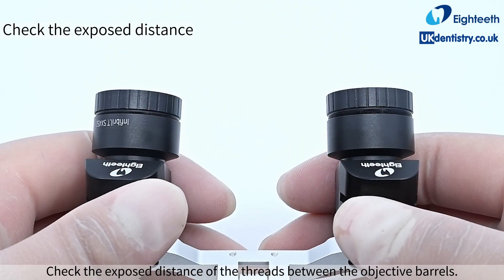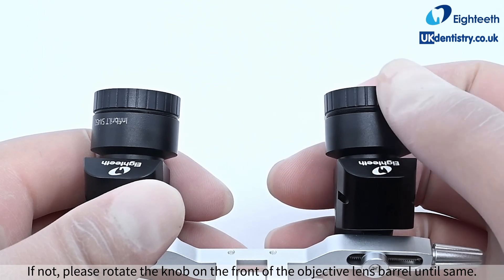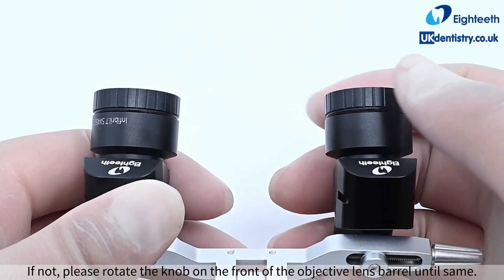Check the exposed distance of the threads between the objective barrels. Make the thread distance exposed on the left and right sides basically the same. If not, please rotate the knob on the front of the objective lens barrel until the distances are the same.